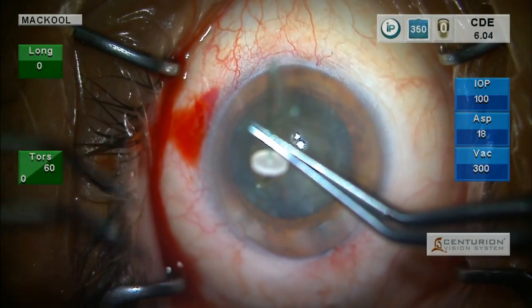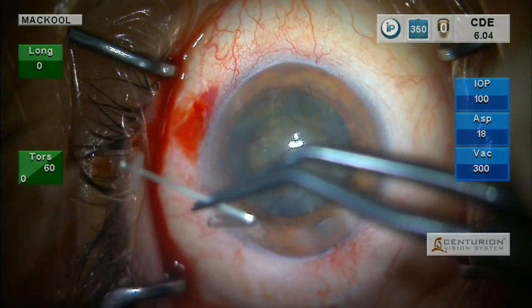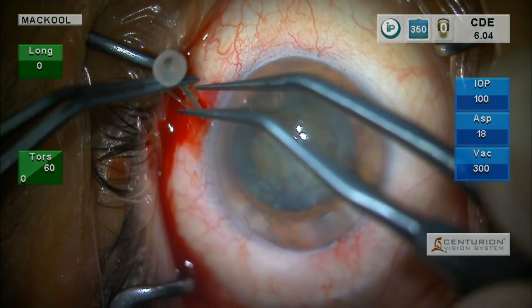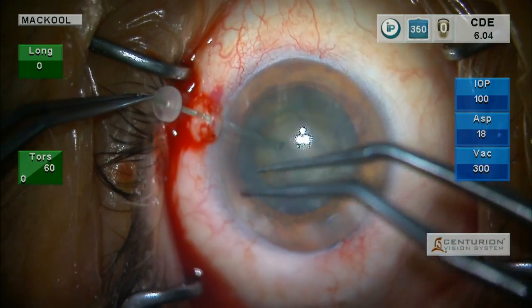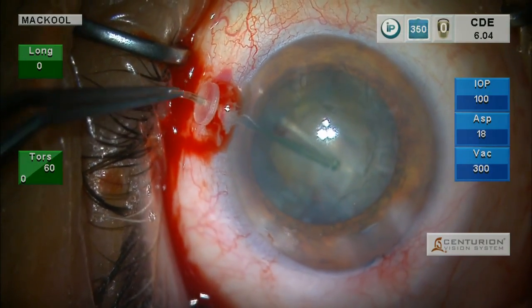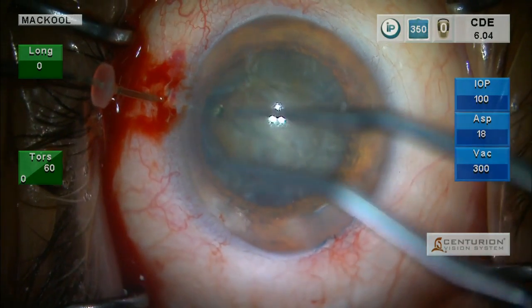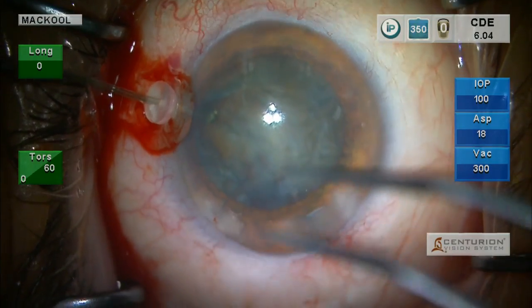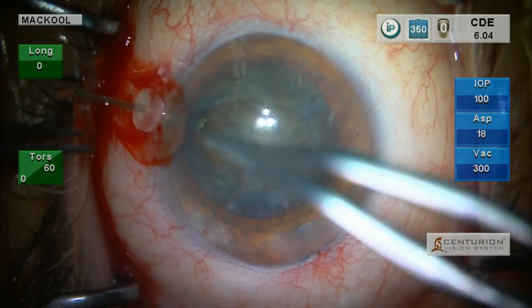These are the MST retractors. There are basically two types of capsule retractors available: the McCool cataract support system retractors, and these retractors. I actually have a proprietary interest in both — both were designed off my patents. I'm using the broader-based MST one here. The idea is not to retract the capsule, but just to approximate it with the edge of the retractor.